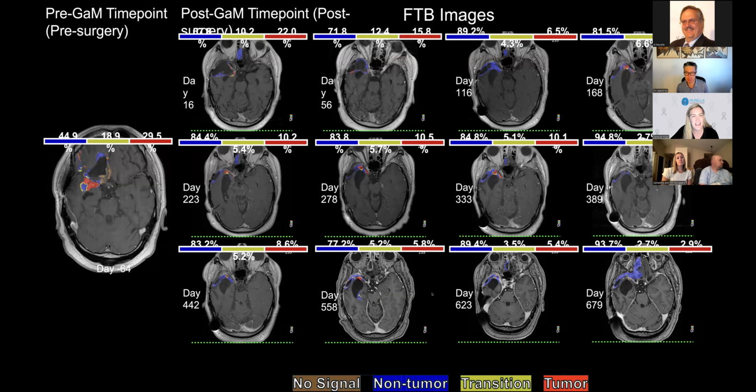Okay. And because we talk to patients every day who do have these indeterminate scans, and it's a matter of their treatment decisions one way or the other, as a practical logistical point, if somebody has the perfusion scans and wanted to get an FTB map done tomorrow, what would they do? Who would they talk to?